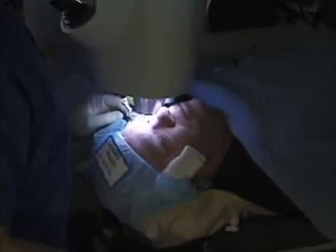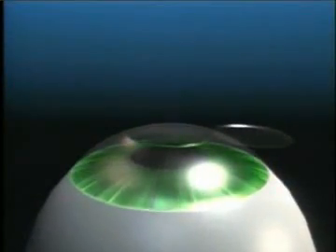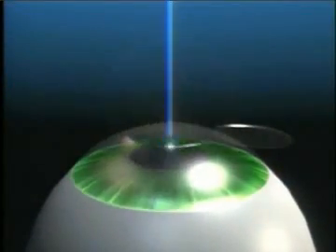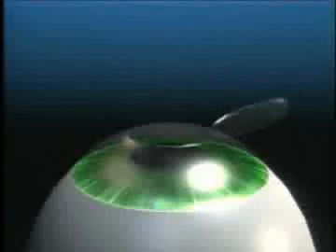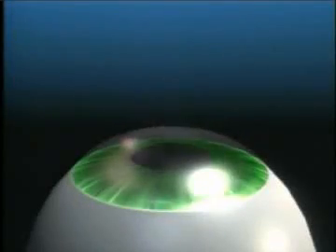There are two steps involved in the LASIK process. The first step is the creation of a flap. After the flap is created, it is then lifted and the treatment is then placed on the stroma of the cornea. After this point, the flap is then returned to its original position.